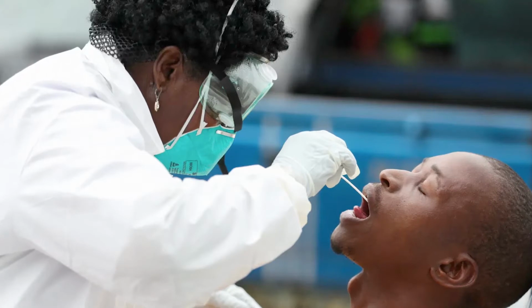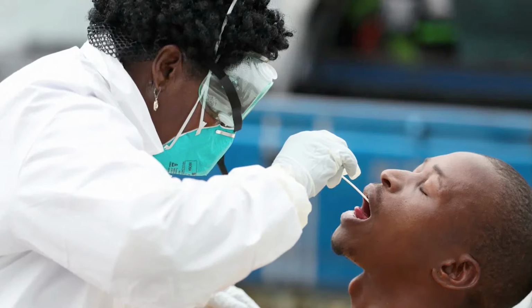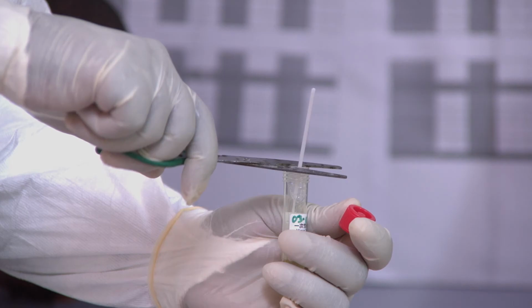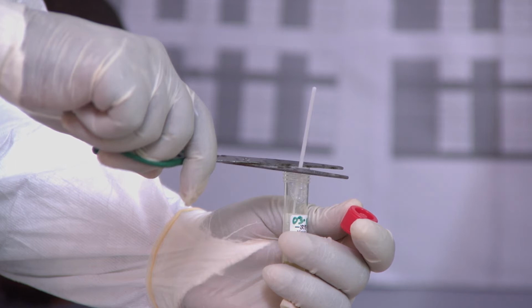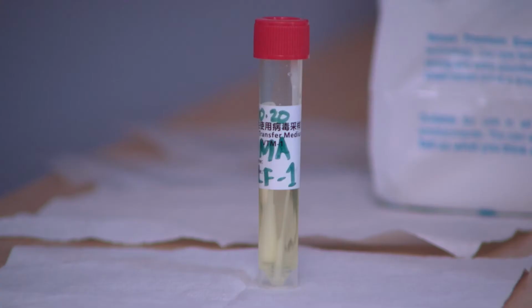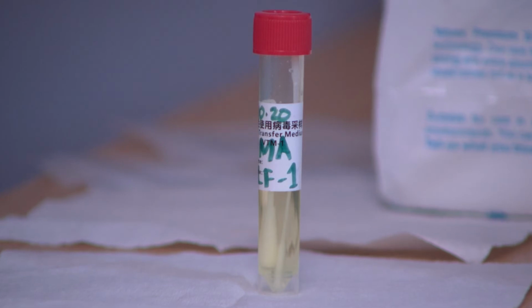Collecting of the oropharyngeal swab. Aim at swabbing the pharynx, the pink area, without touching the tongue or the tonsils. Place the swab into the tube containing the viral transport media. Lift the swabs slightly upwards and cut the plastic handle using the scissors previously disinfected. The part of the swab left in the VTM should allow one to close the cryovial with ease.